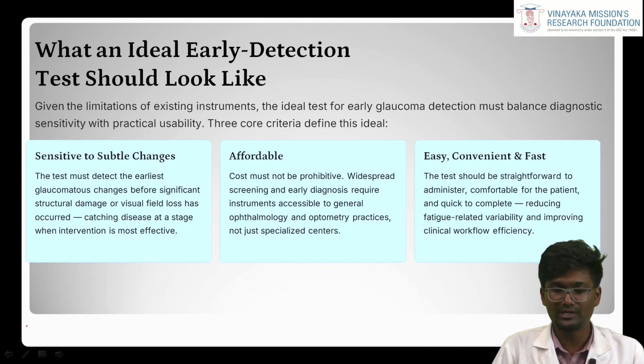Cost must not be prohibitive. Widespread screening and early diagnosis require instruments accessible to general ophthalmology and optometry practices. Cost must be very, very low for screening purposes.